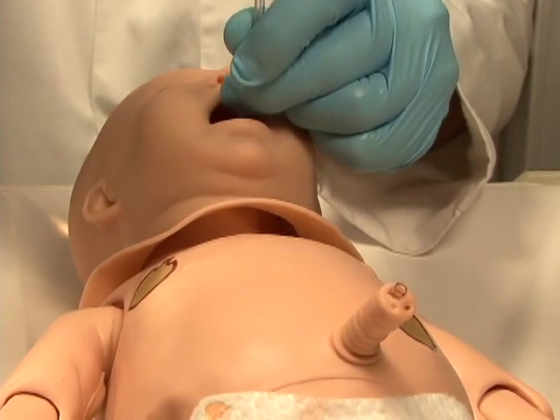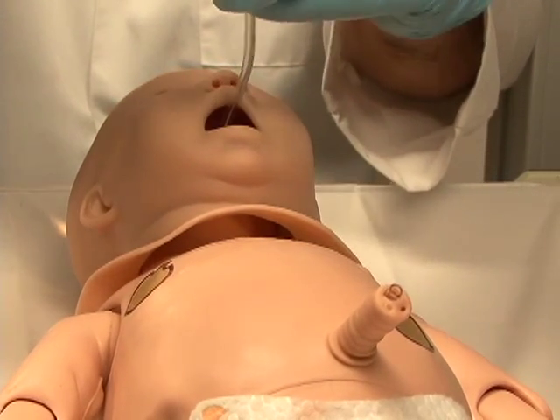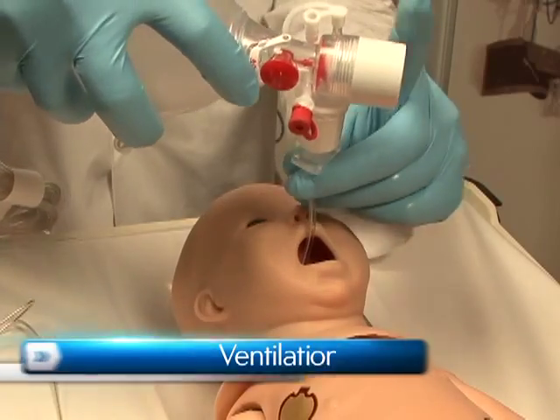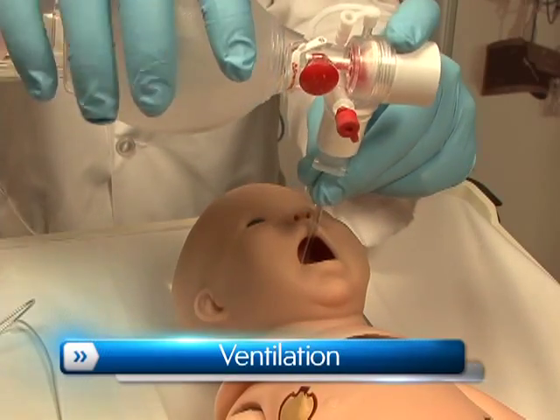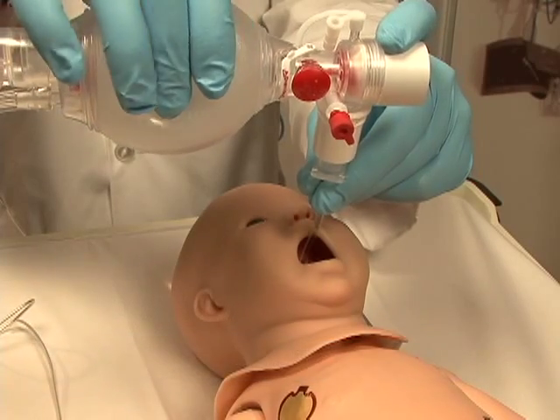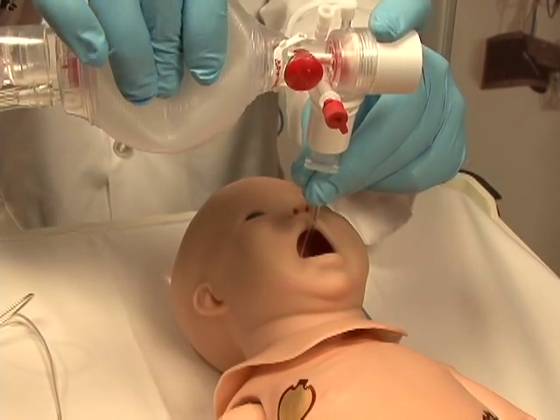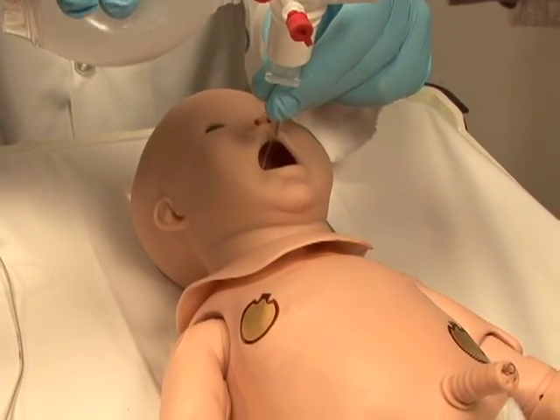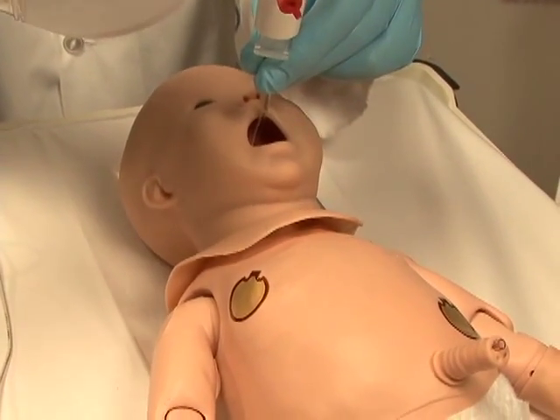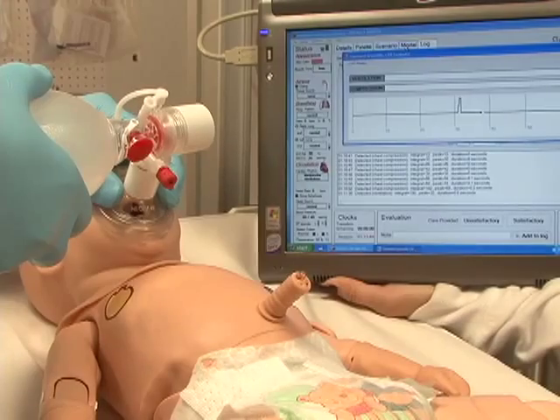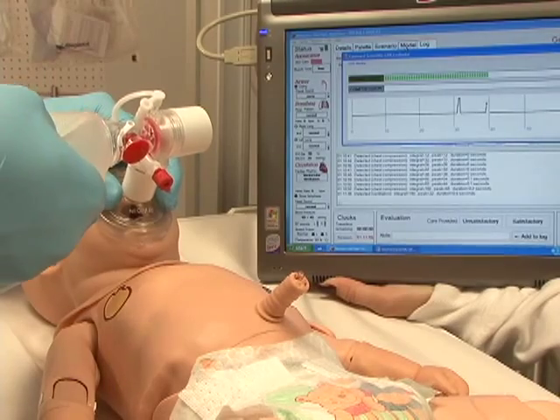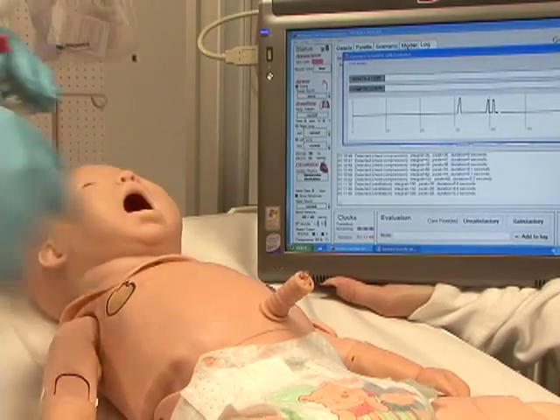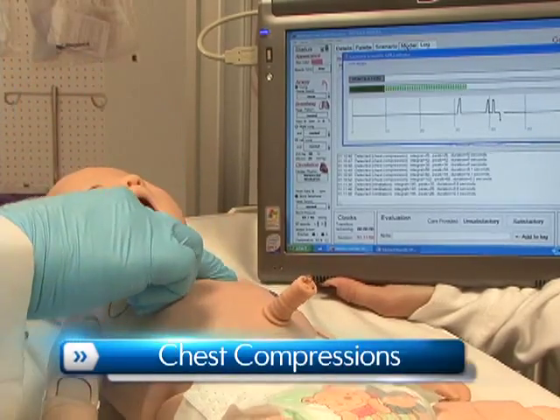Correcting the tube position re-enables the left lung. Additionally, Newborn HAL can be ventilated with a BVM or a mechanical ventilator. Ventilation and manual chest compressions are measured and logged, showing the instructor exactly how students are performing.